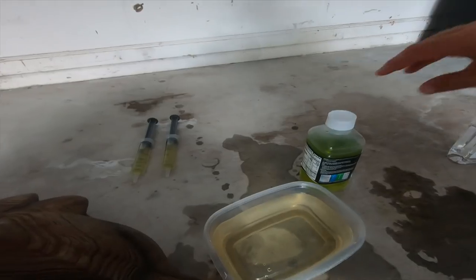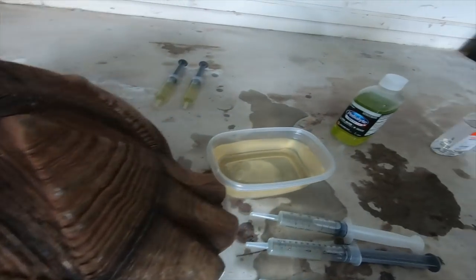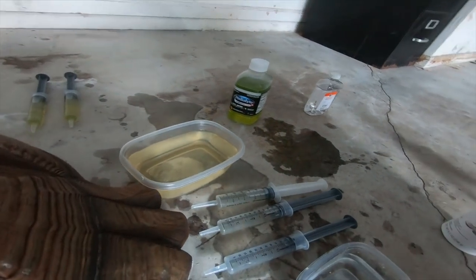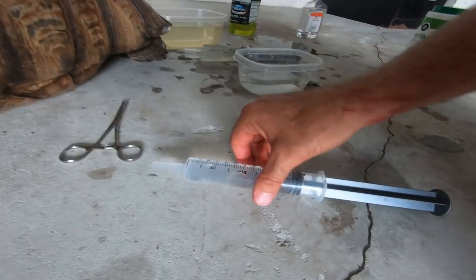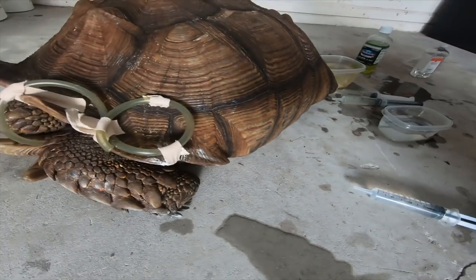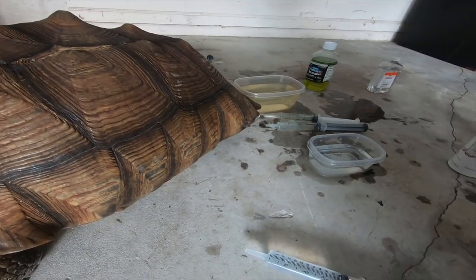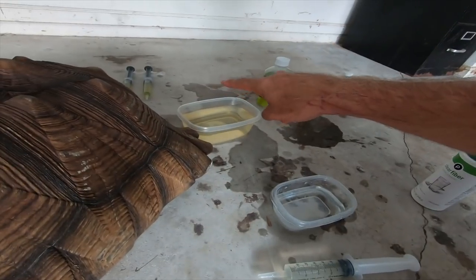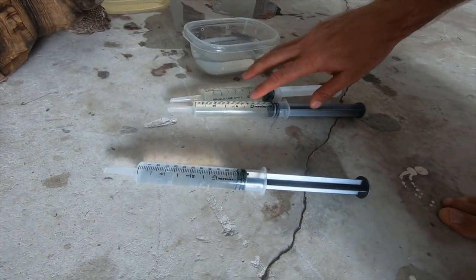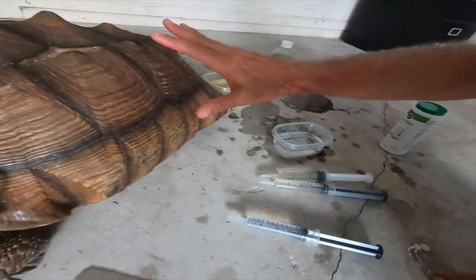So we've got something called Pedialyte. Pedialyte's made for people. It has a lot of electrolytes. So we're gonna actually pump 2 vials, okay? And then we're also gonna put 50 milliliters. Where did my 50 ml of mineral oil go? Here it is. This is our mineral oil. That is also something that is gonna be used to kind of loosen up his stool, okay? Lubricate his alimentary canal or digestive system. Then we're gonna flush it with some water, okay? And then we're gonna put the Pedialyte in, and then I'm gonna also flush it again with some more water, bringing us up to 500 milliliters of liquid in this treatment.